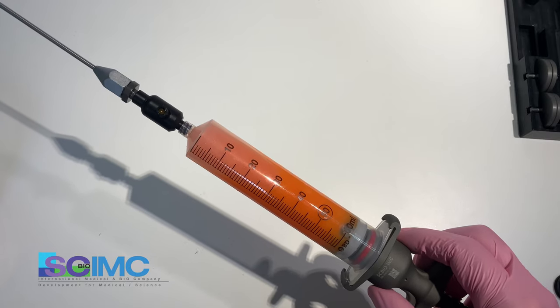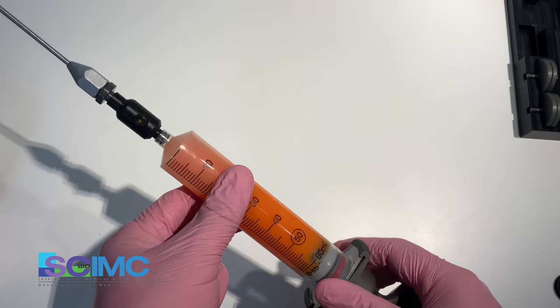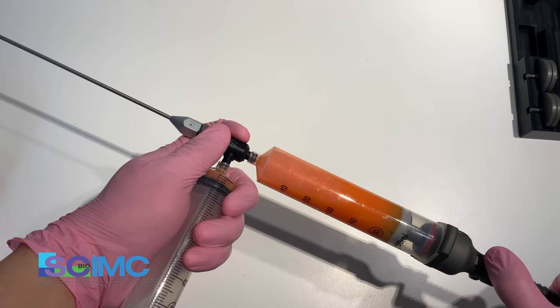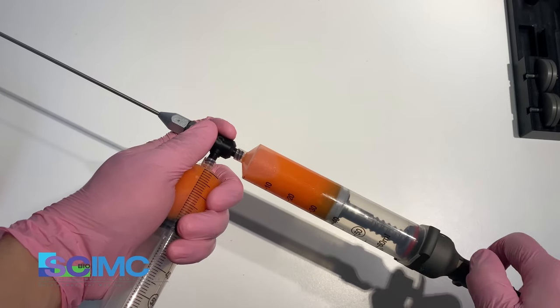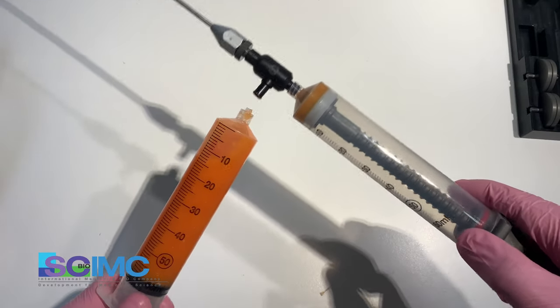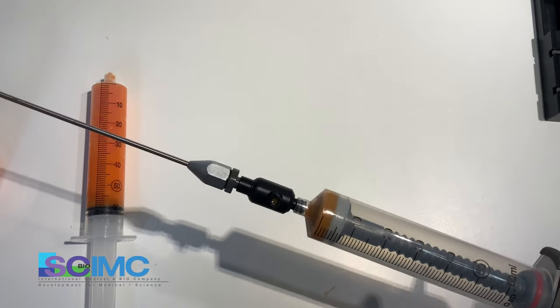When you finish harvesting fat, you don't need to change the syringe. Connect empty syringe to here. Hold tight and push it. Remove the syringe and start harvesting again.